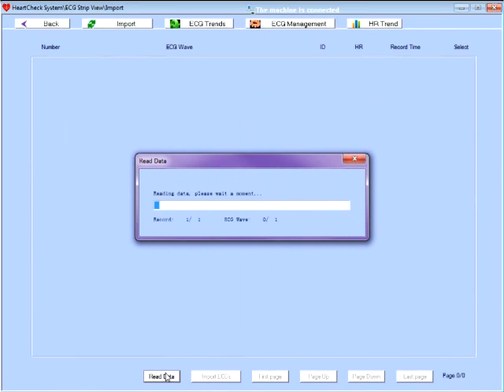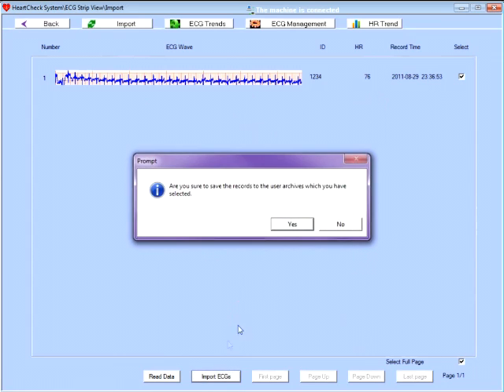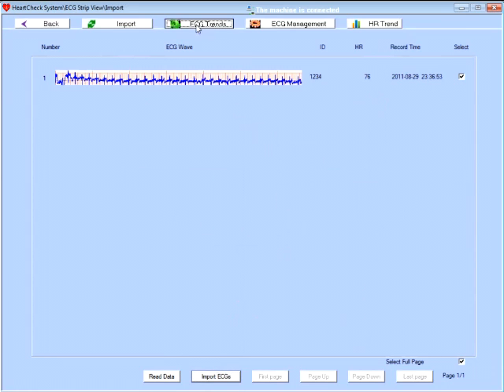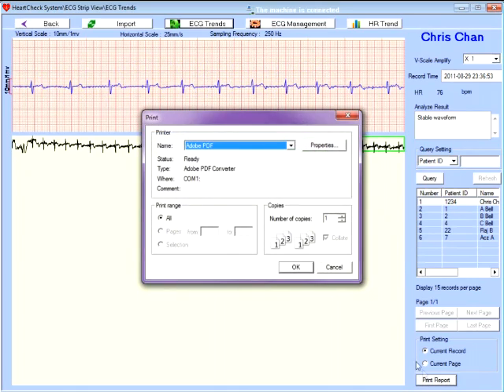When the patient finishes the analysis, the device is returned to the receptionist, who connects the ECG monitor to a computer through a USB cable. The data can then be transferred, analyzed, and printed through the computer for the doctor to review during the appointment.